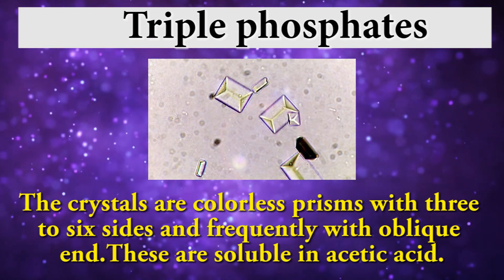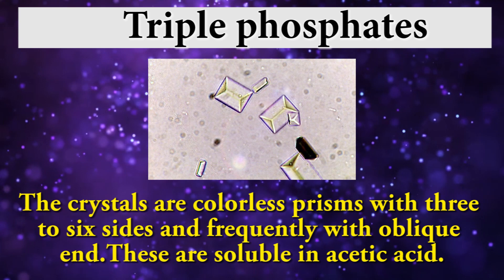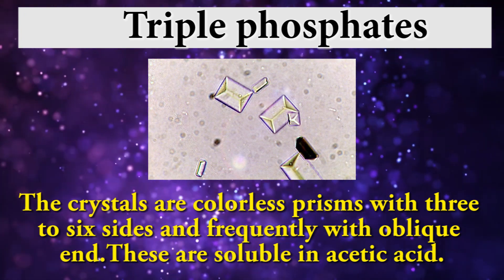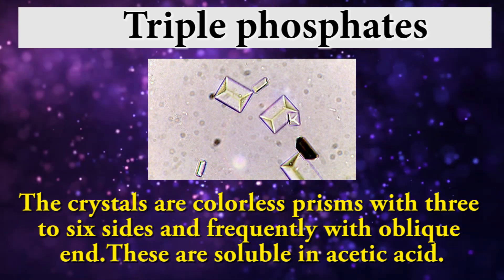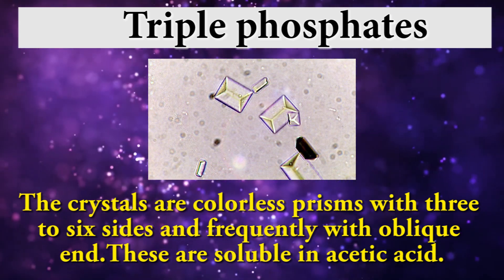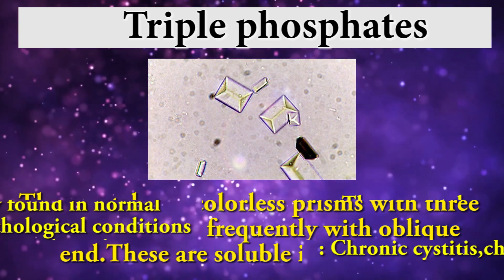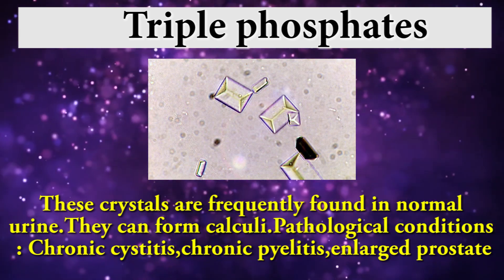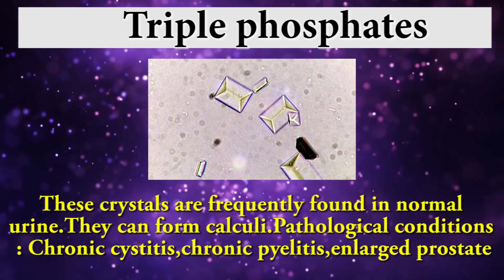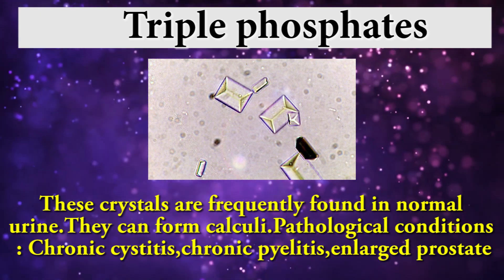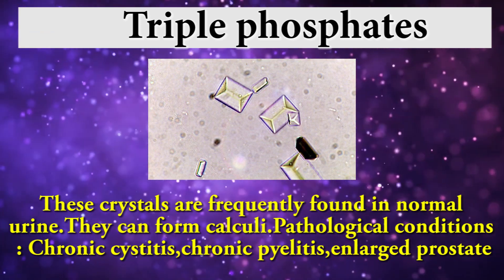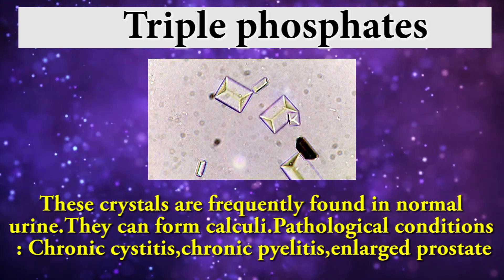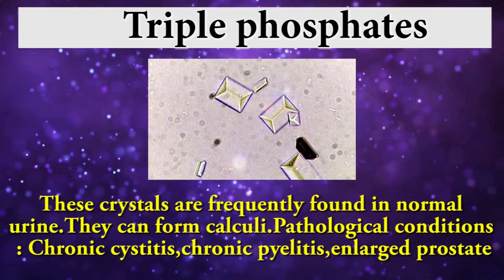Triple phosphates: these crystals are colorless prisms with 3 to 6 sides, frequently with oblique ends. These are soluble in acetic acid and are frequently found in normal urine. They can form calculi. Pathological conditions associated include chronic cystitis, chronic pyelitis, and enlarged prostate.